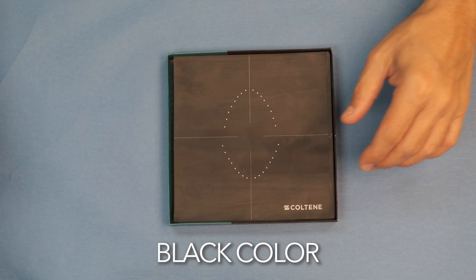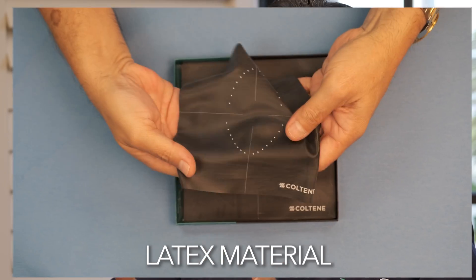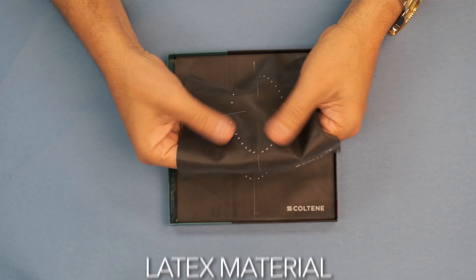Why? Number one: the color black — very good contrast. Number two, and very important personally to me, is that it's made out of latex, very resistant, and it actually helps with retraction. So for me, this is really a game-changer in the market.